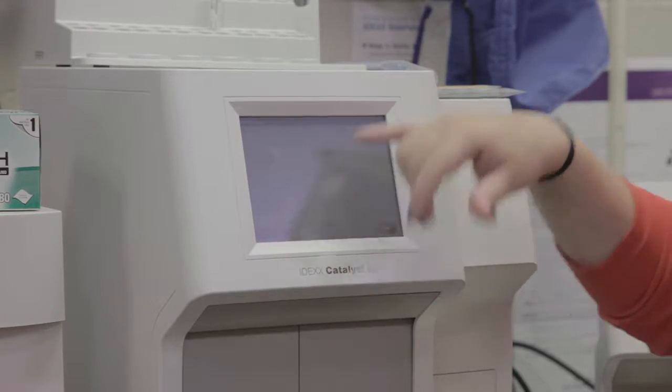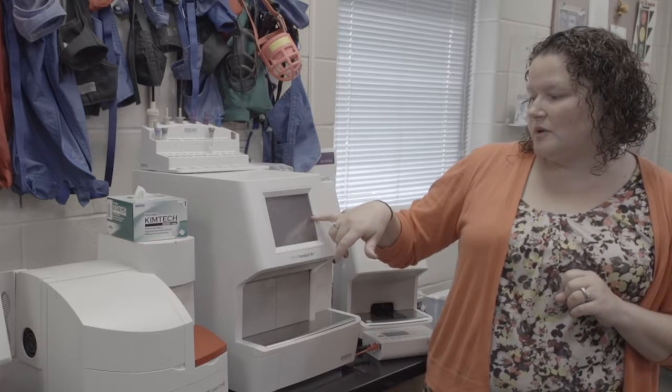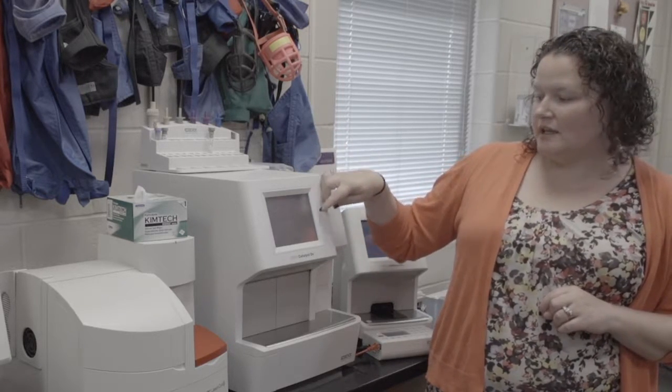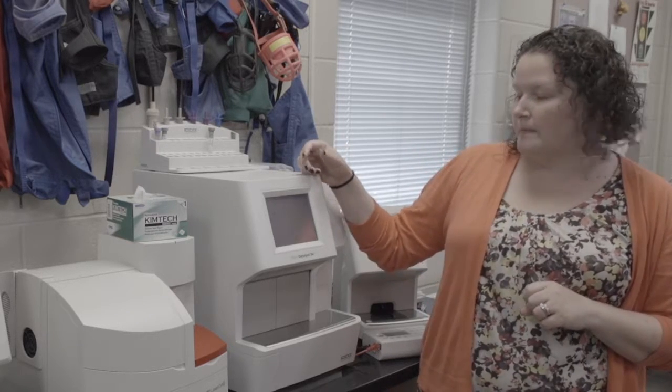Under special slides, you have the option to run ammonia. You have to tell it if you're running ammonia because ammonia has to be ran separate from other slides. It can actually be affected by the other slides. And then the PHBR is phenobarbital. If you guys are running phenobarbital, it has to be ran by itself. So you have to tell it, I'm running phenobarbital, so it knows to not allow you to run any other slides at the same time.